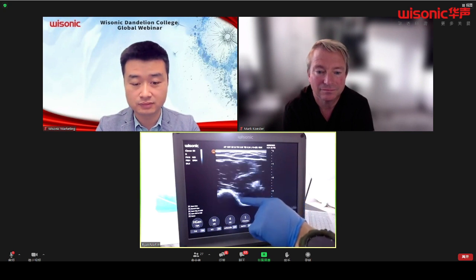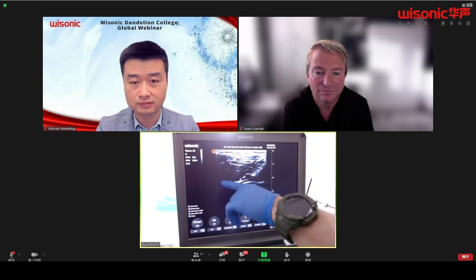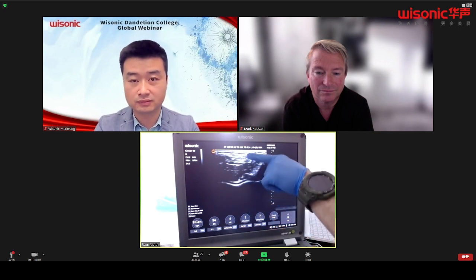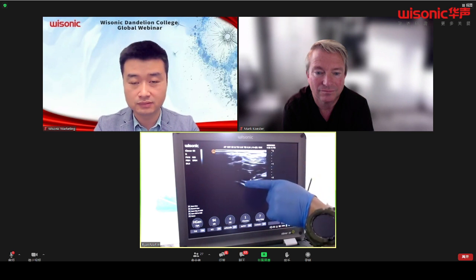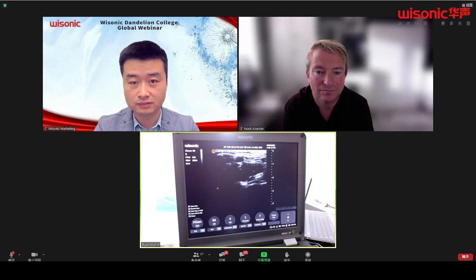As we come down, remember, we're going to look for that cartilaginous space. And it looks, let's supinate that arm here real quick, like right in here. So once you see this supinated area, you can see that cartilage right through here, the hyaline cartilage, right up onto the top. Let me make sure that my finger's not in the way here. This is the biceps brachii. We move over medial. You see that big brachial artery right here. When in doubt, throw a little color on it.